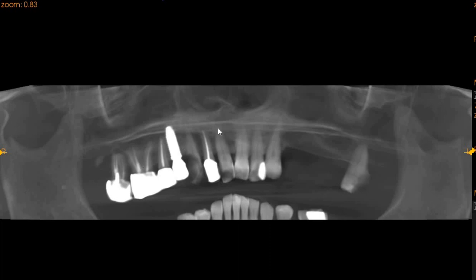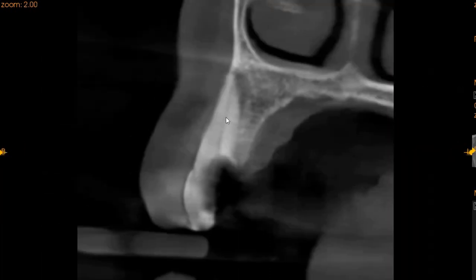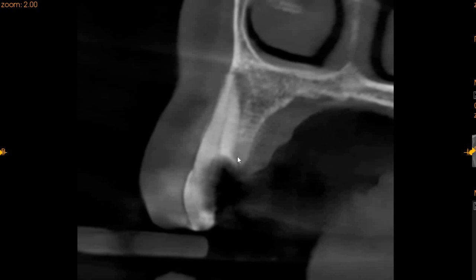In the upper right, we have the canine placed at a buccal segment. It also has a periapical radiolucency and it is carious. If we can measure the ridge width for you, it is 8 millimeters and the ridge height is approximately 15 millimeters.